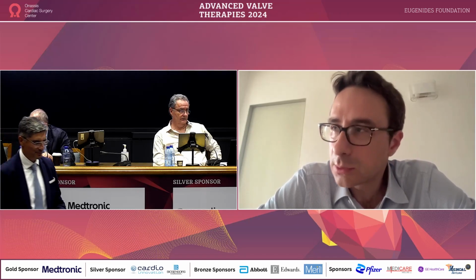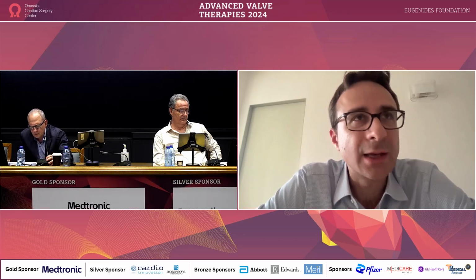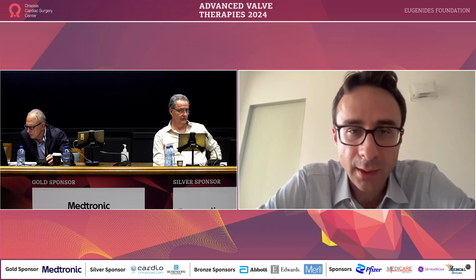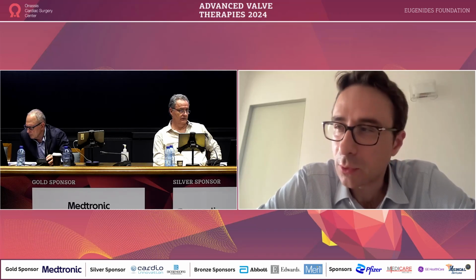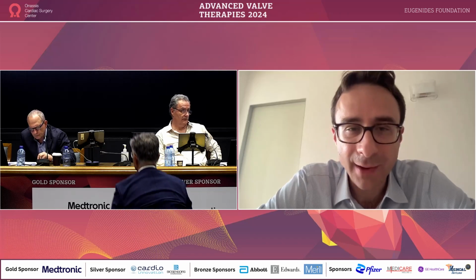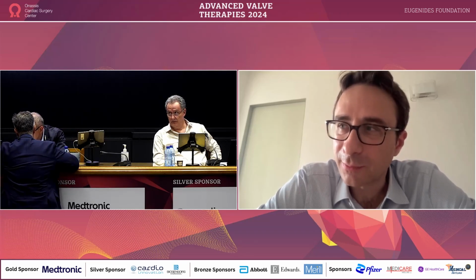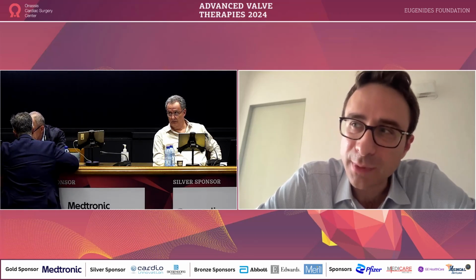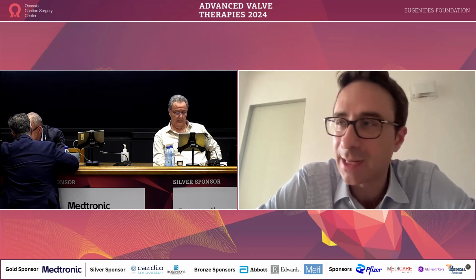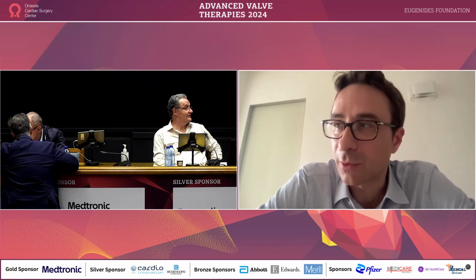Now we know, also looking at the data that were just presented before my presentation, that even a minimal leak can be a problem for our patients. So we always have to try to get the optimal final result. Sometimes that's not possible, and it needs to be a balance between the risk of trying to deploy the device again and again, and the fact that you can accept it or not.